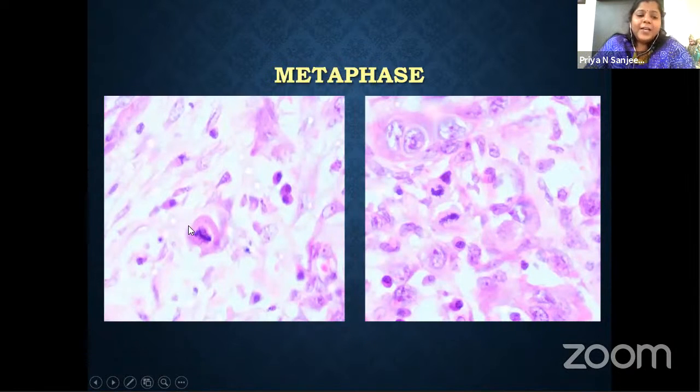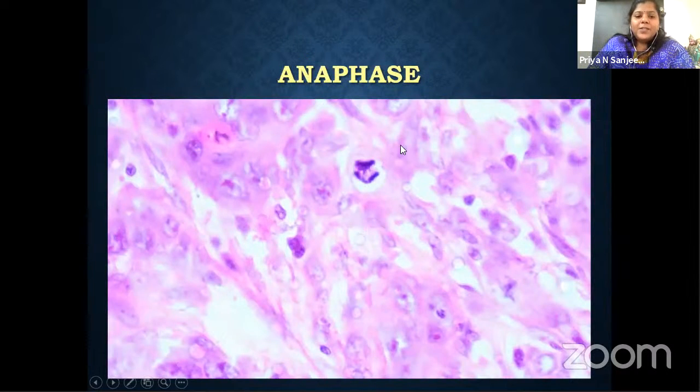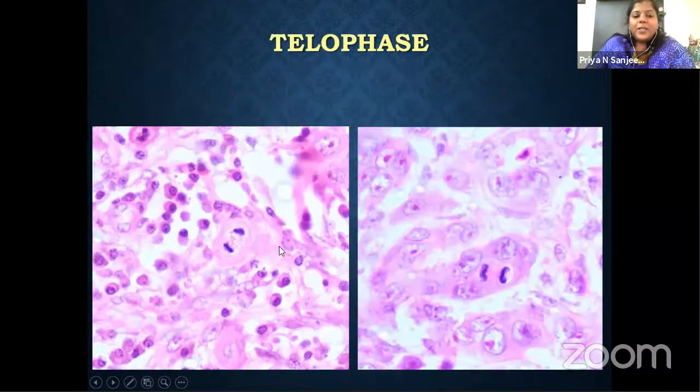Then metaphase, it is called caterpillar cell. You can see the little elongated structure, again with nuclear irregularity because of the loss of nuclear envelope. Third stage is anaphase, where they're retracted to the opposite poles and they're connected through a thread. And again, it is irregular because of the loss of nuclear envelope. The last phase is telophase, where there is a division. Here, the nucleus is trying to gain its shape. There is formation of the nuclear envelope. So it is not that irregular. So this is telophase. You can identify.